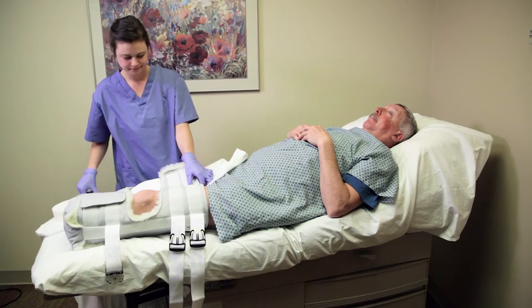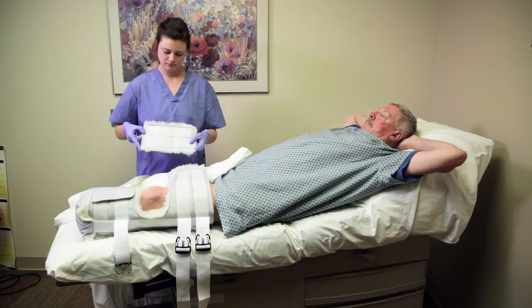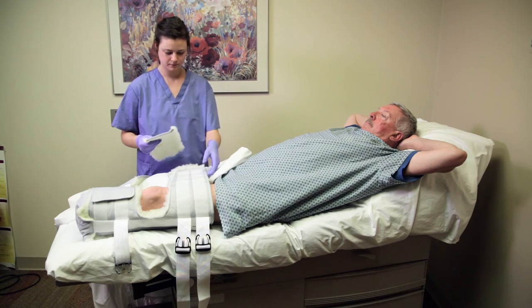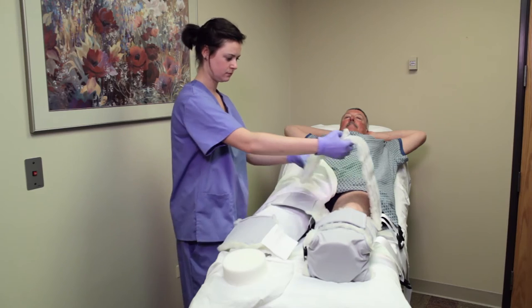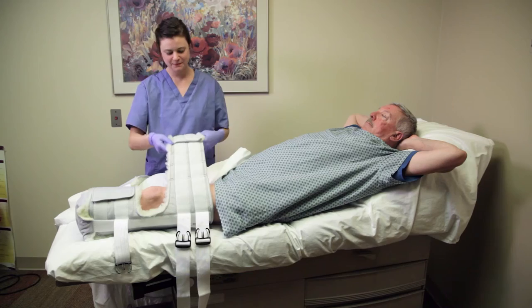Again, use the scissors to trim for a more slender thigh. However, if you have a patient whose leg girth is exceeding the proximal or distal flap, locate the extender and attach it to the flap, extending the reach of the flap.